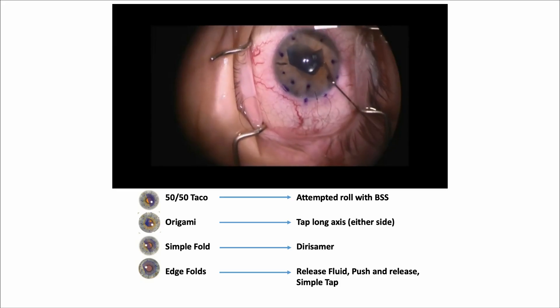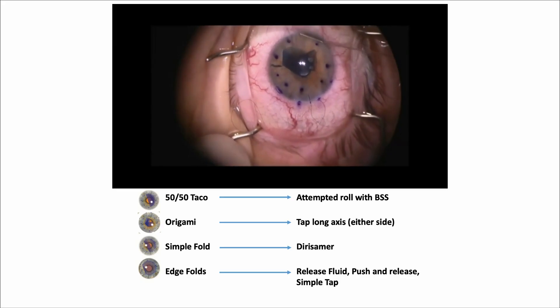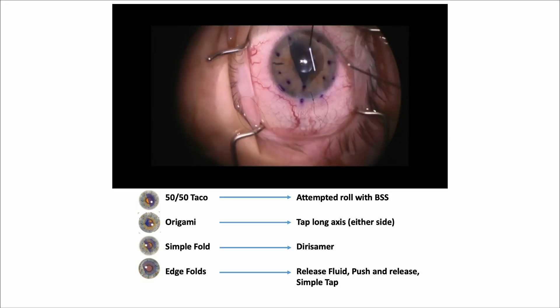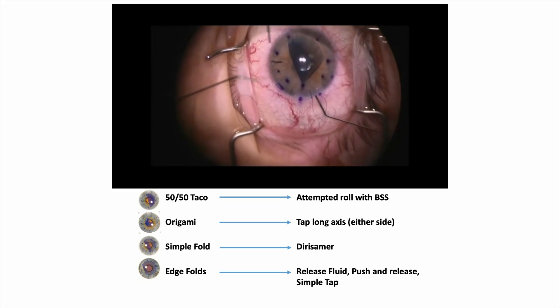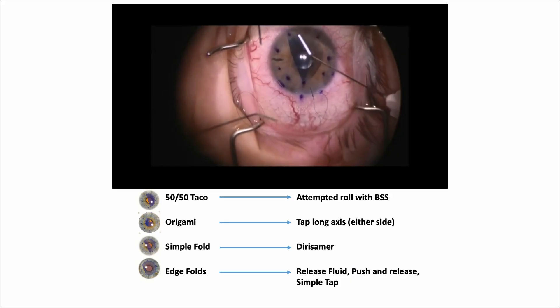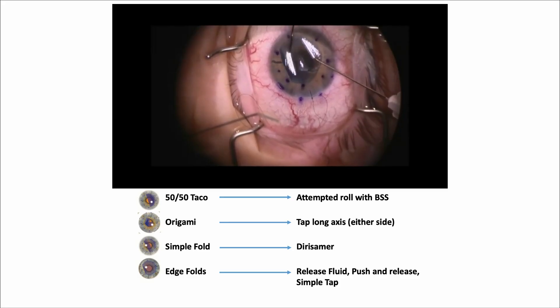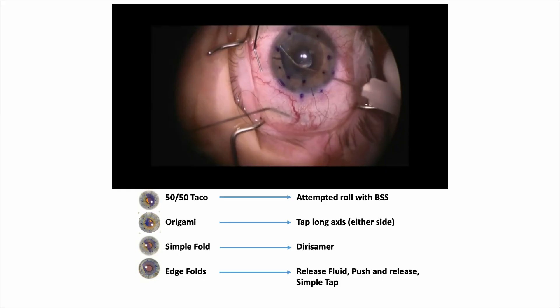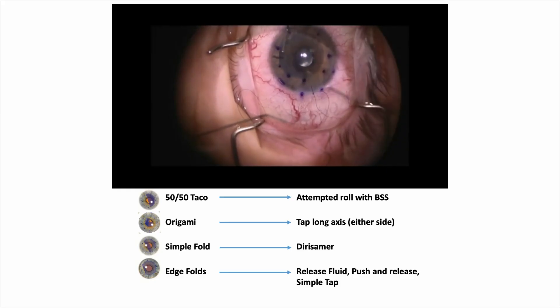A combined technique demonstration starts as a 50/50 taco: attempt a roll with BSS — it becomes origami. Tap the long axis on either side, and it becomes a simple fold. Apply the Derisamer technique — hold pressure with one cannula, tap with the other, add a little fluid — and it becomes an edge fold. Release fluid, apply simple taps, and it opens right up. All techniques can be combined in sequence.